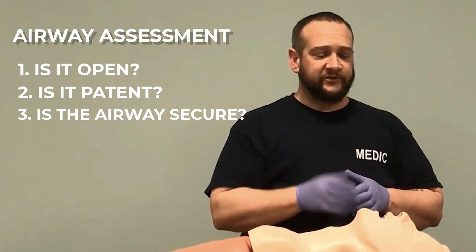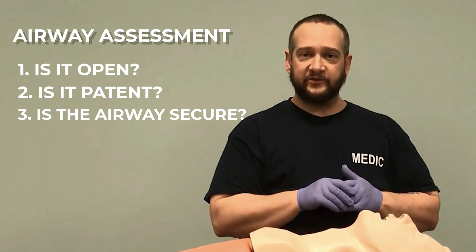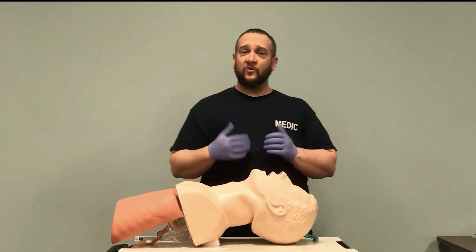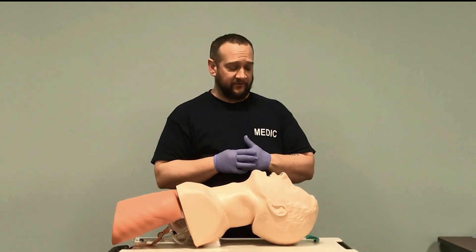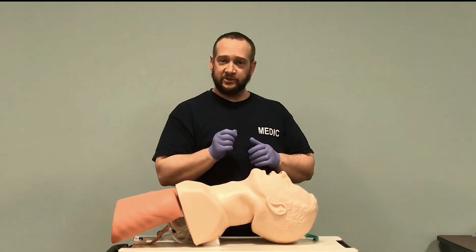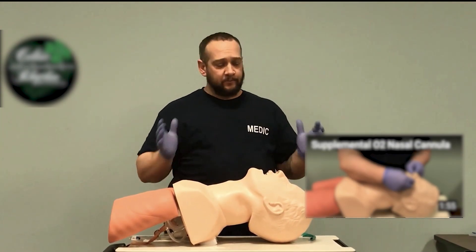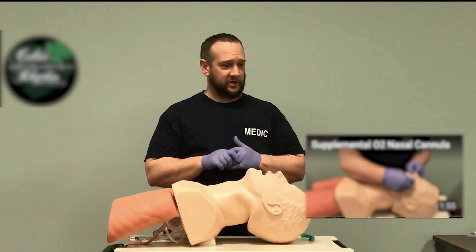If unresponsive with no gag reflex, use the OPA — sized from the corner of the mouth to the corner of the ear — rotated 90 degrees until the flange is flush with the lips. If semi-conscious with an intact gag reflex and no facial trauma contraindications, use the NPA — sized from the tip of the nose to the tip of the ear, bevel towards the septum, twisty-turny method. If resistance is met, try the other naris. Whatever is needed to manage the airway, this is a high-priority patient every single time.